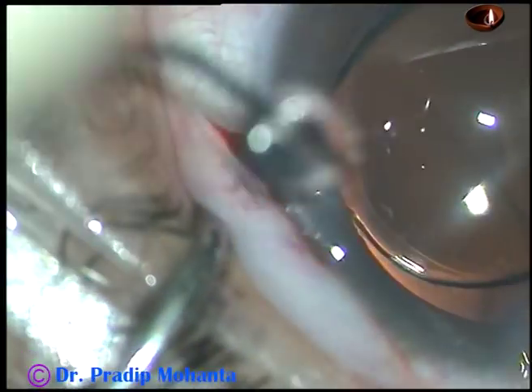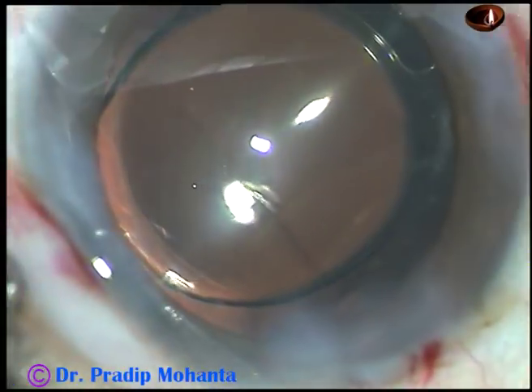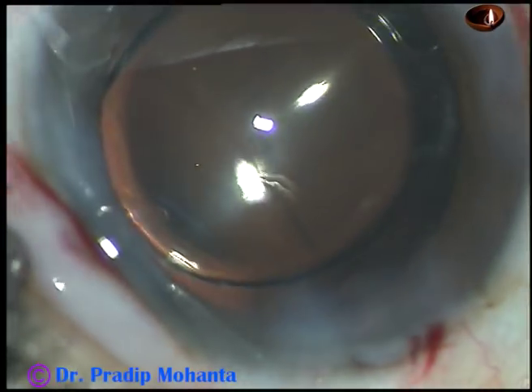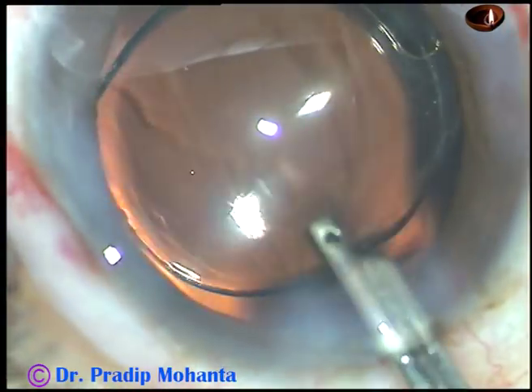Hydrate the scleral side and inject only little bit of fluid. Don't inject lot of fluid on the corneal side. You can cause a DMD, Descemet's membrane detachment.